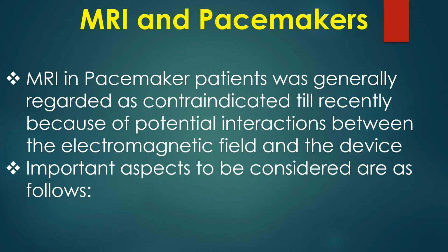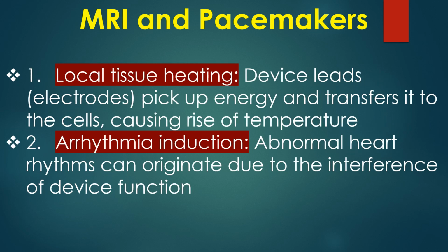MRI in pacemaker patients was generally regarded as contraindicated till recently because of potential interactions between the electromagnetic field and the device. Important aspects to be considered are as follows. 1. Local tissue heating. Device leads pick up energy and transfer it to the cells, causing rise of temperature.